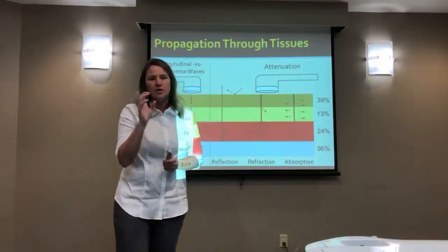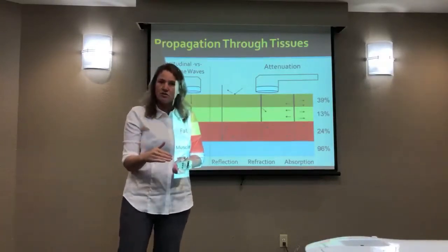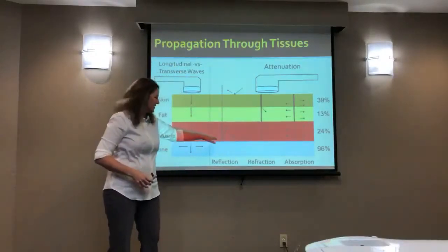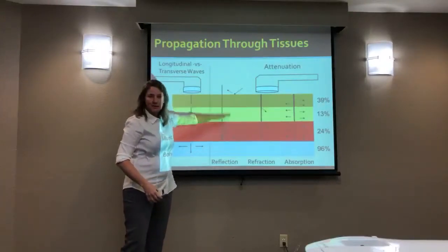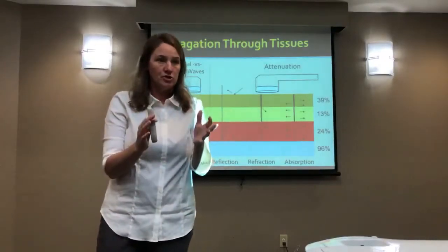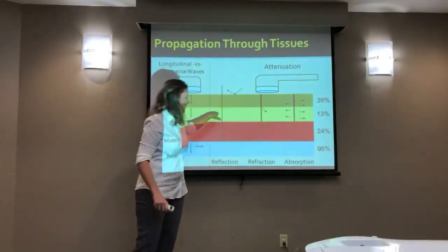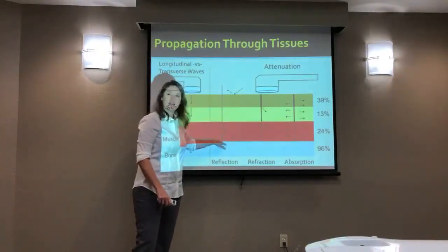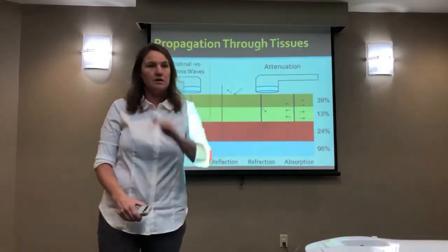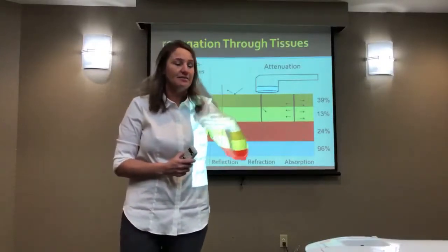So this is why with ultrasound, you can heat and deliver more energy to deeper structures than superficial structures. So you can be getting hotter and more physiologically affected at the deeper level than up here because of the nature of how it reflects off. So that's very unique, and it's very helpful to know that information, because sometimes you don't want that to happen. The challenge is if you're treating something in the area superficial to it, but it gets hot down here. That can be a challenge to try and target something midway between the surface and the bone. It's hard because those tissues are just simply hard to isolate.